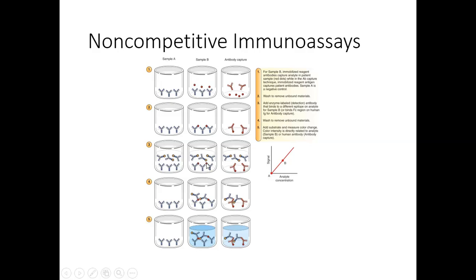This, we bound off antigen. This antibody binds to the antigen, and we now have a complex of immobilized antibody, antigen, and then enzyme tagged antibody. We created a new complex after that had incubated. What do we do? We wash. We're going to wash between this step. We wash. What do we need to do after we wash that time? We need to add the substrate to that enzyme, right? This enzyme here and here.